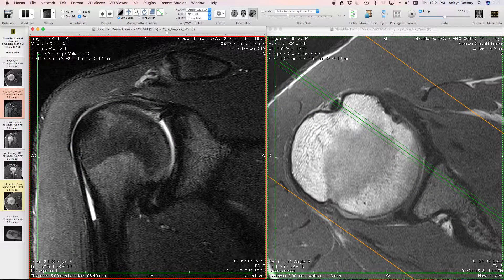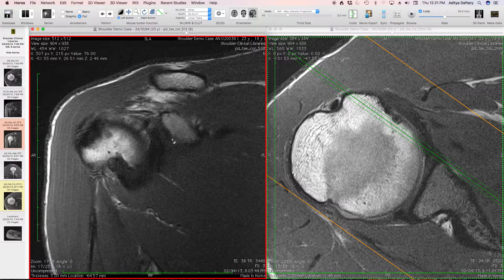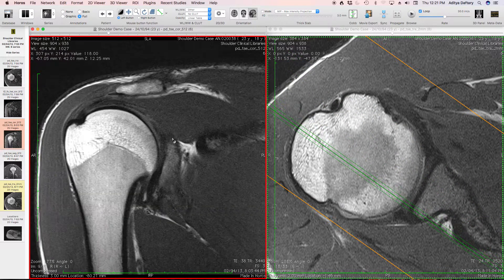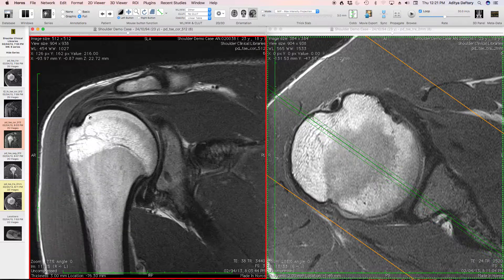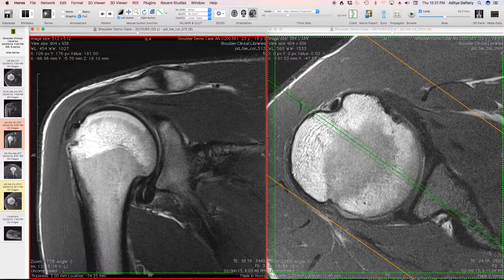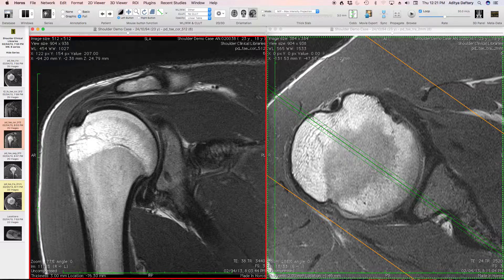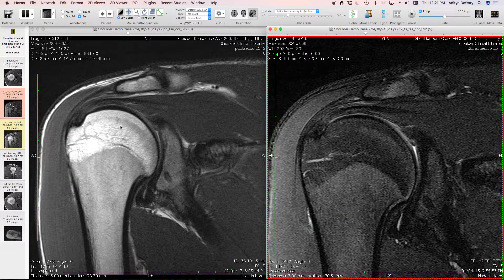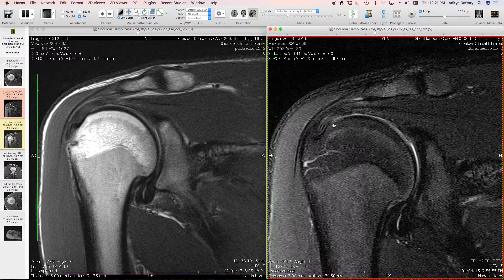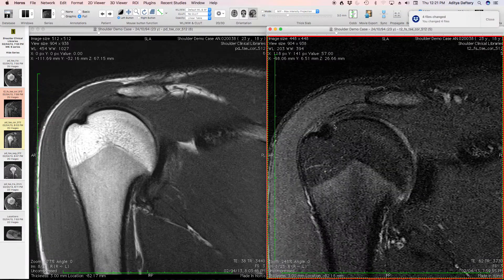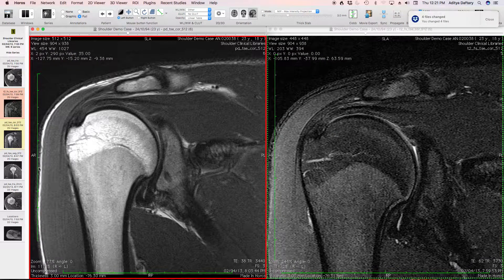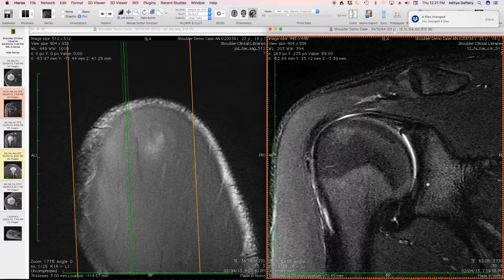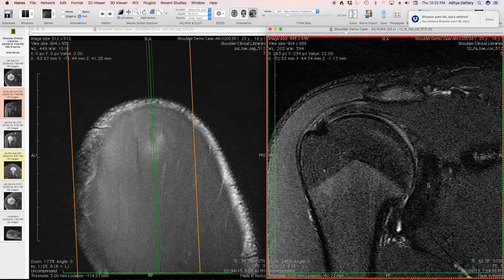Moving on to assess the rotator cuff: the supraspinatus is the first tendon we look at — the cigar-shaped muscle inserting into the greater tuberosity. The tendon itself shows some heterogeneous architecture. It's not dark in signal, but the signal intensity seems exaggerated on the non-fat-suppressed images compared to the fat-suppressed images, suggesting mild supraspinatus tendinosis.